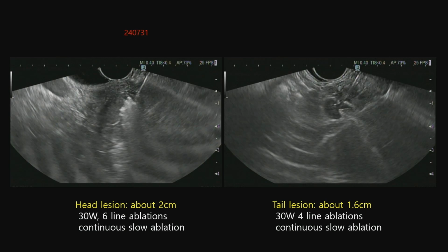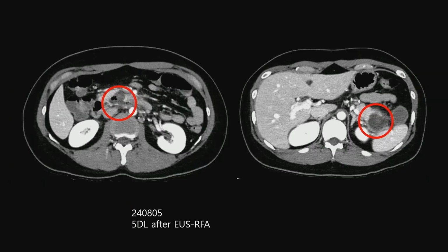For the ablation of 2 cm head lesion, we used 30 watts and 6 line ablation with continuous mode. 1.6 cm tail lesion was ablated using 30 watts and 4 line ablations. After ablation, the patient developed low-grade fever and abdominal pain. So we checked CT follow-up 5 days later. The head area shows retroduodenal perforation here, and the tail lesion showed large necrosis.